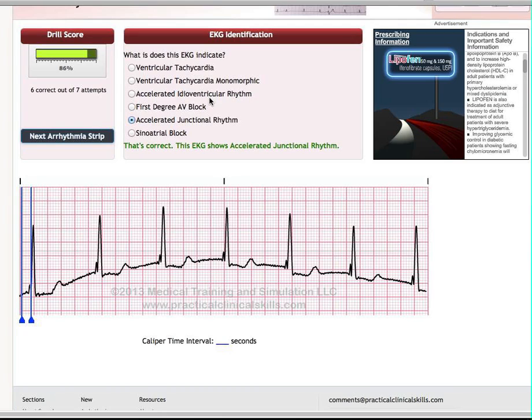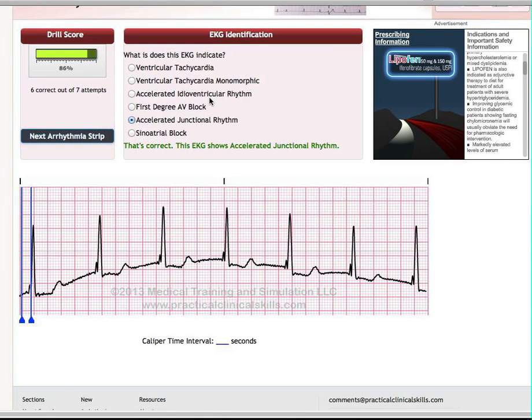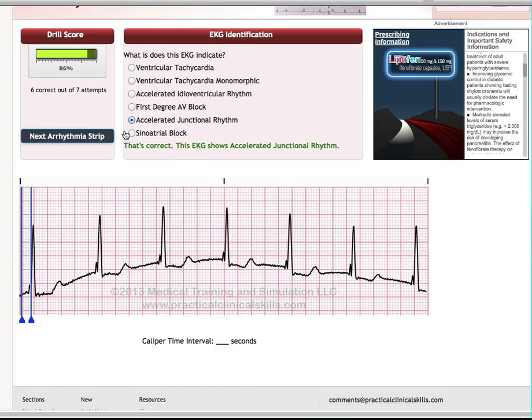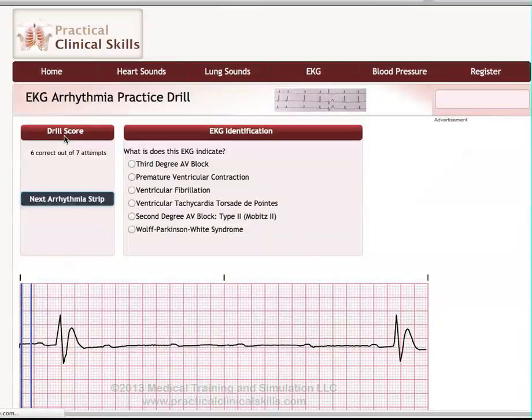So you kind of need to have a multiple view approach. I like to have a multiple view approach when I diagnose that. So it's kind of a tricky one. I would recommend reading up on it and seeing if you can find some 12-lead EKGs to kind of diagnose that. That usually helps.